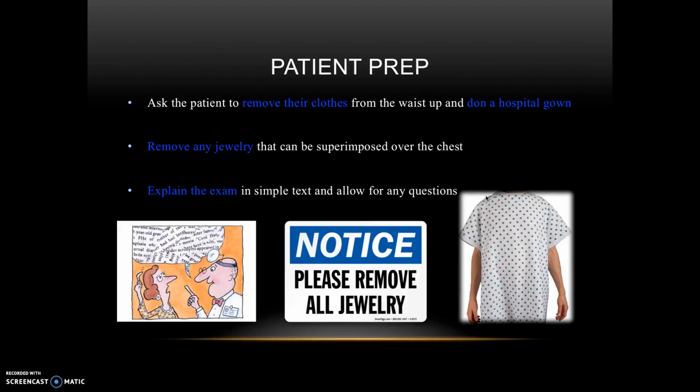Before we can take a chest x-ray, it is important that the patient is properly prepped. By this I mean we're going to remove the patient's clothing from the waist up, and we're going to put a gown on. We're going to remove the shirt. We just want to make sure there's nothing in the shirt that can cause artifact on the images. So males, have them remove the shirt and place a gown. Females, they have bras, so we want to make sure the bras are removed.